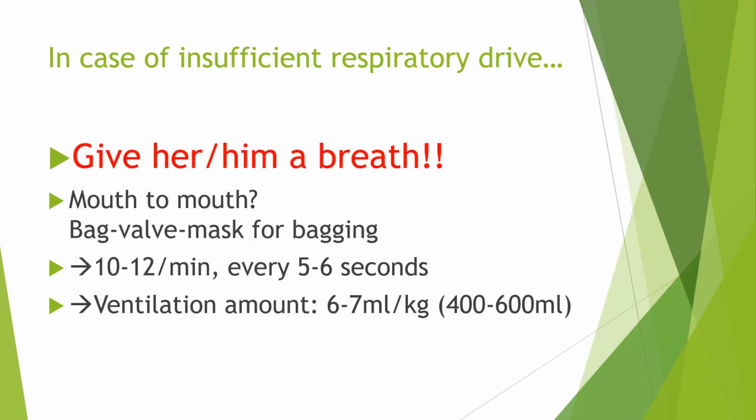In case of insufficient respiratory drive, what should you do? You should help them by giving them a breath. How to give them a breath? In the old times, we used mouth to mouth, but not anymore. Now we use the bag valve mask for giving the patient a breath. During BVM, we will give 10 to 12 breaths per minute, which means about every 5 to 6 seconds.